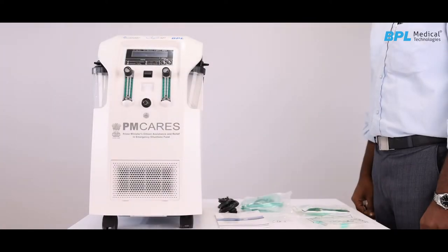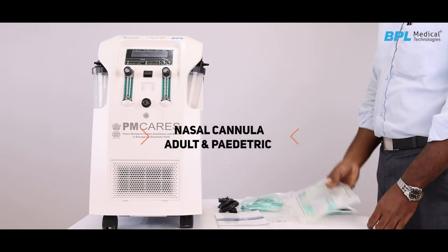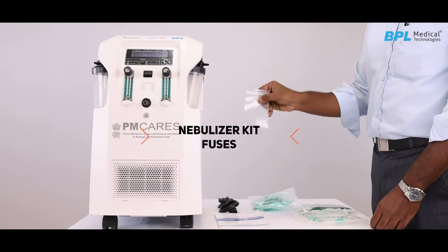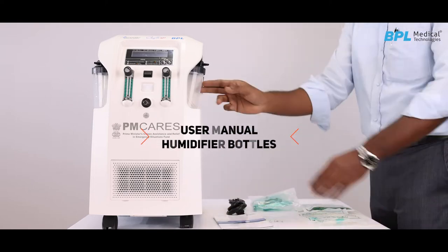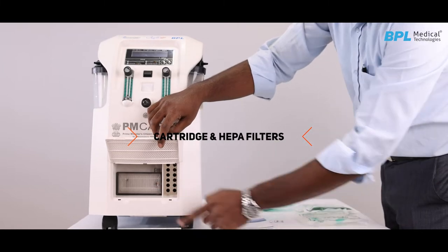The standard accessories are nasal cannula — adult and pediatric — nebulizer kit, fuses, user manual, and humidifier bottles. Cartridge and HEPA filters are preloaded in the factory.